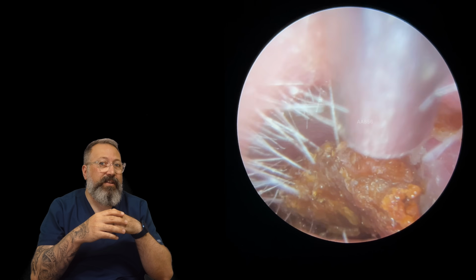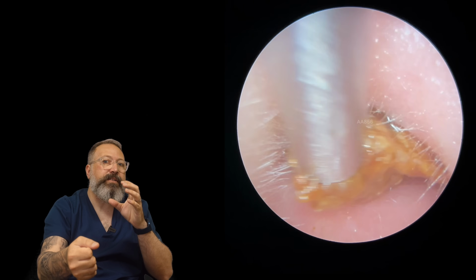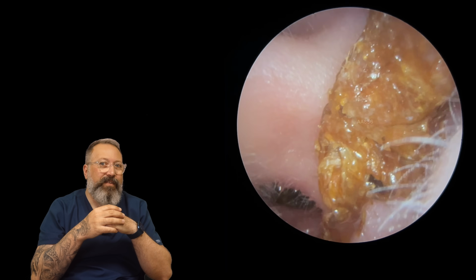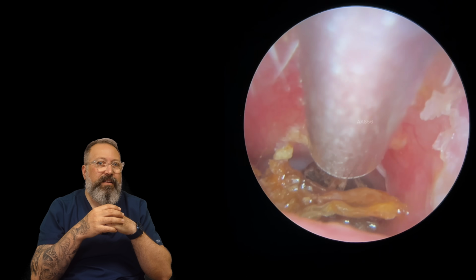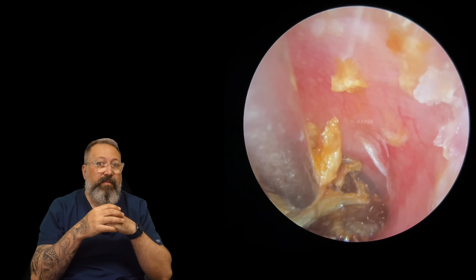But look at this now. Look, as we're pulling it, see it got pulled back into the ear canal. And that's because there's a long strip, there you go, look, of keratin on the back of that one as well. This was so dense, this stuff. Let's have a look now. We're getting to the last of it. It was one strip, that's keratin there, that strip. So we'll get rid of that.